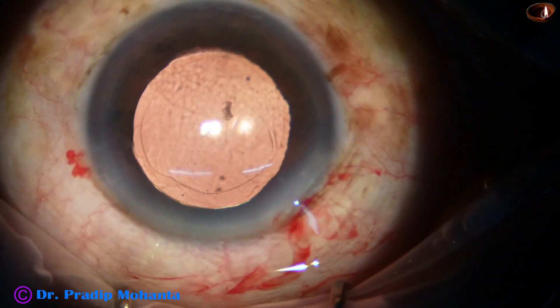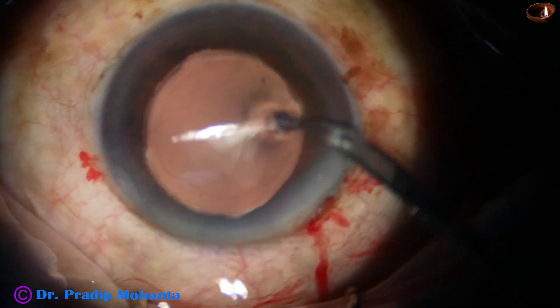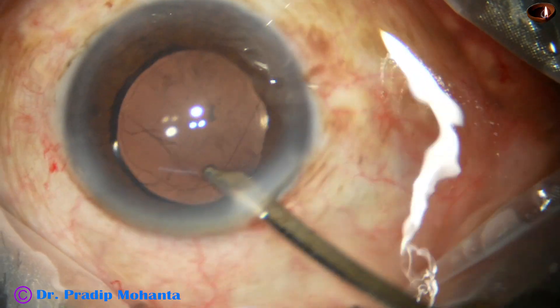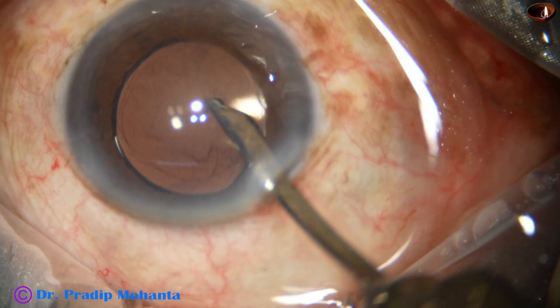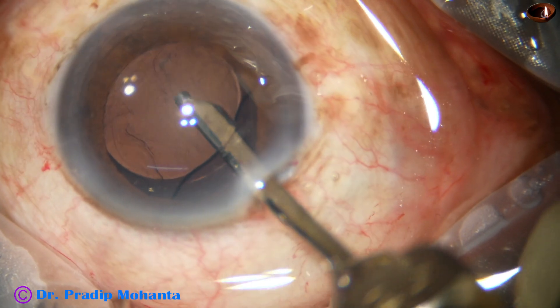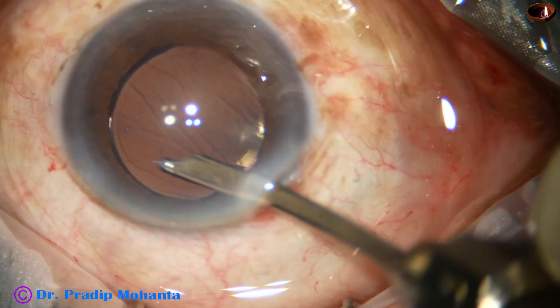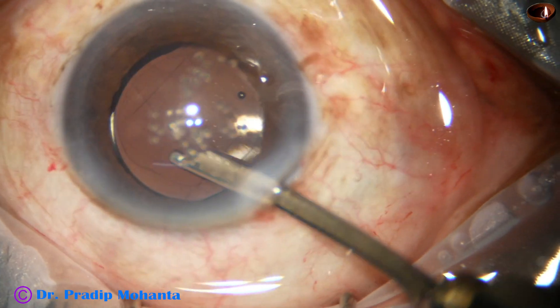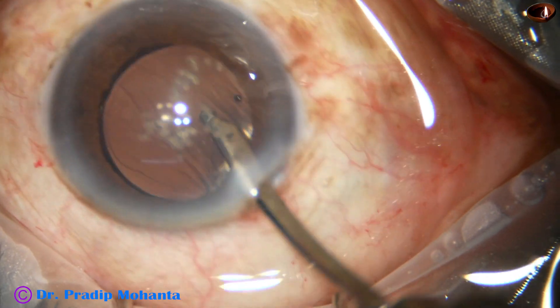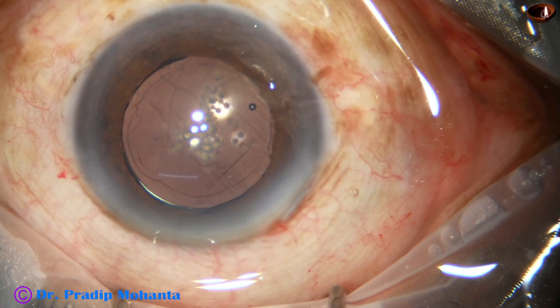The lens has been rotated to orient it in such a way that I can go behind the intraocular lens to clean visco from the bag. I am irrigating BSS — I go behind the lens and irrigate BSS in the bag. Then I come into the anterior chamber and aspirate some visco, and come out.